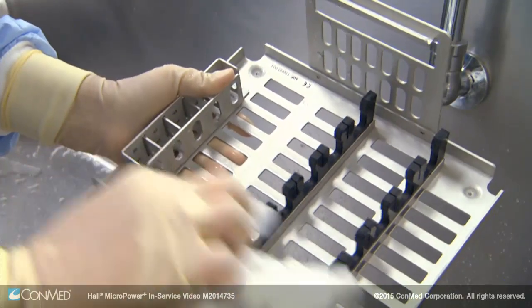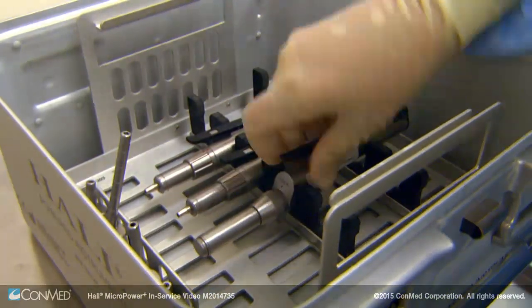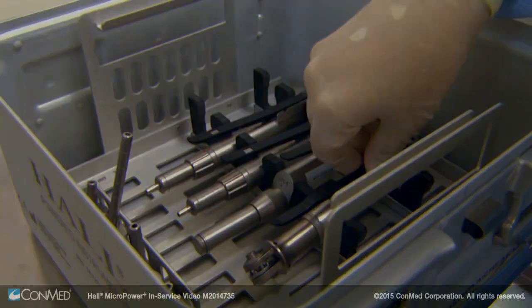Finally, dry the tray with a clean, lint-free towel. With the Micro Power Plus System components manually cleaned, sterilization can begin.